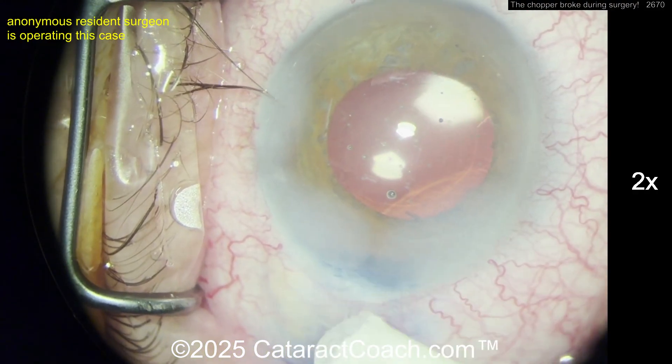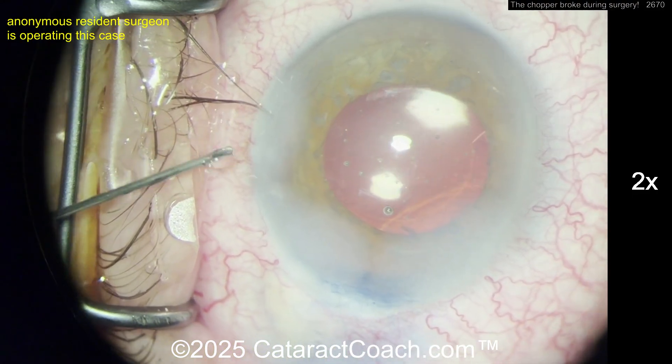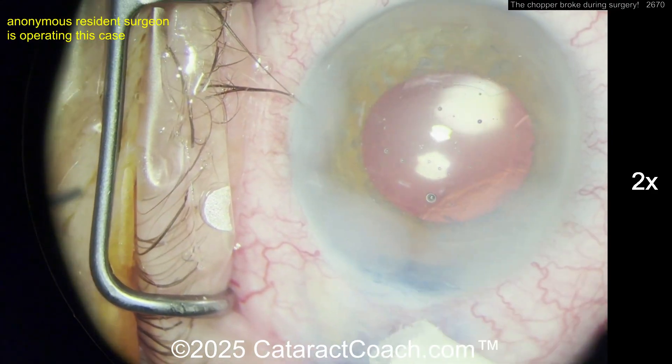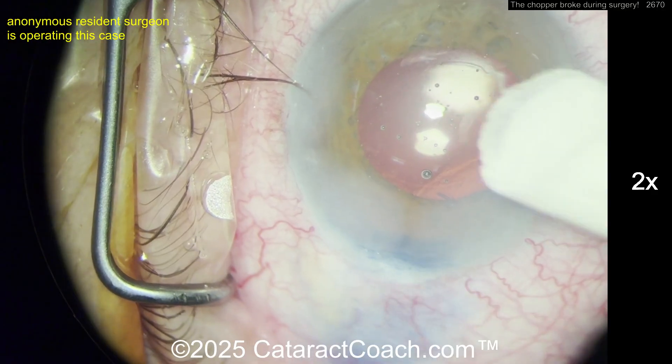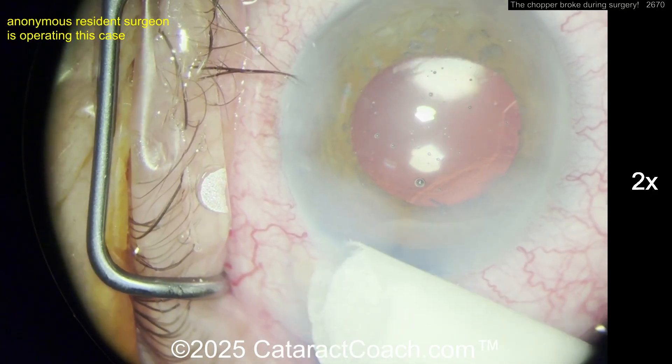He's sealing up the incisions at the end — great job, good rescue. Let's make sure everything else is okay. The bleeding has subsided. I'd be tempted to quickly put the gonioscopy mirror up so you can see what's going on at the angle.